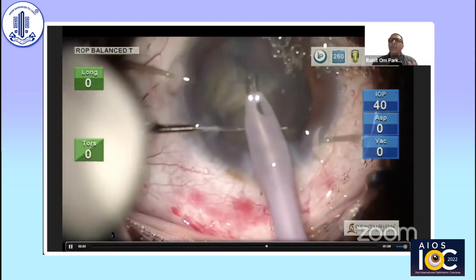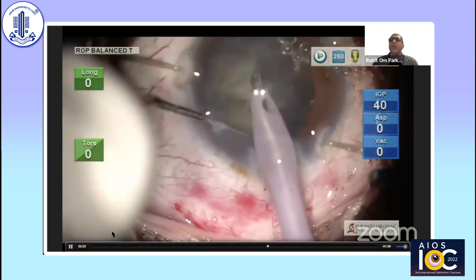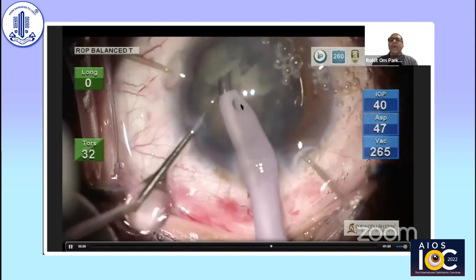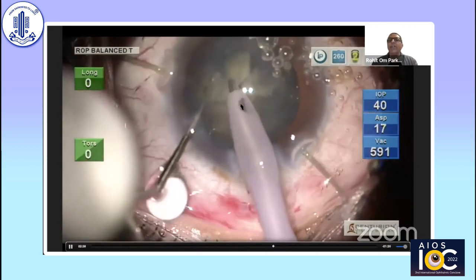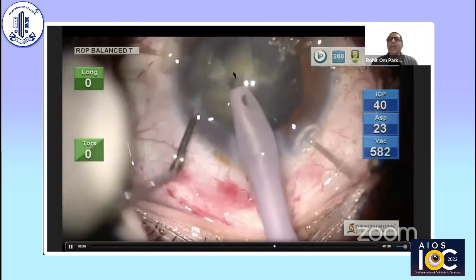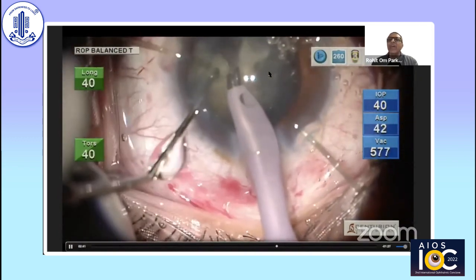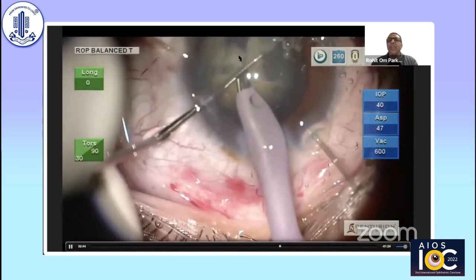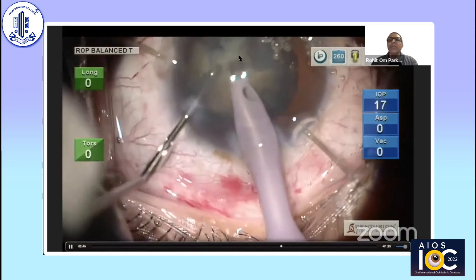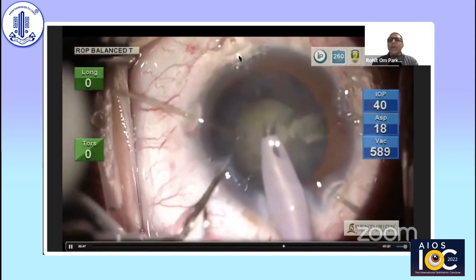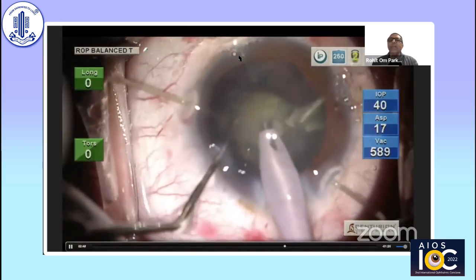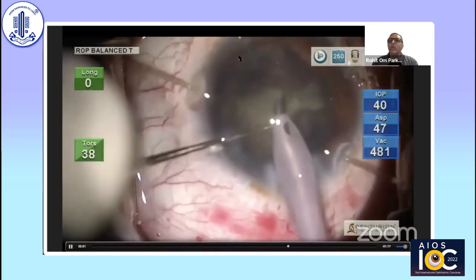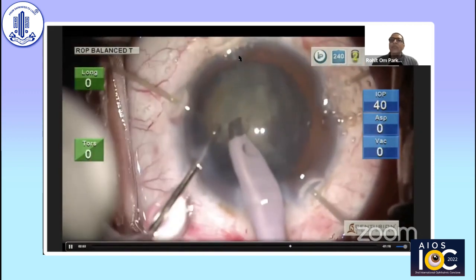Another important thing that could have been done here was rotating the hard nuclear fragments and moving them into the area where zonular presence was less. In that situation, the fragments would have provided three-dimensional additional support to the capsular bag.